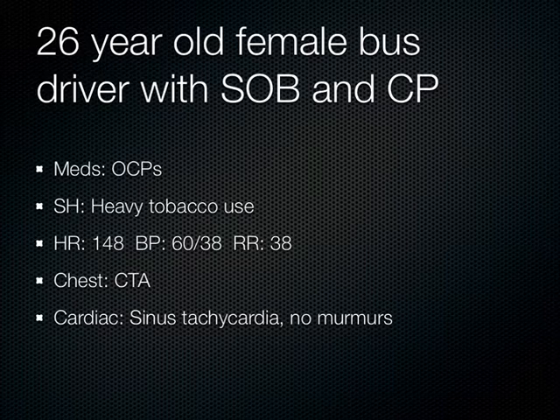Okay. So can you put someone like this in the CT scanner? You could, but... Have the medical students seen this too? No. Oh, good. Okay. So what does a PE look like on ultrasound? Normally you've got the left ventricle and you've got the right ventricle. The right ventricle is about 2/3 the size of the left ventricle, correct? You with me? So what happens during a massive pulmonary embolism to cause this derangement of vital signs? The right heart gets bigger than the left heart.